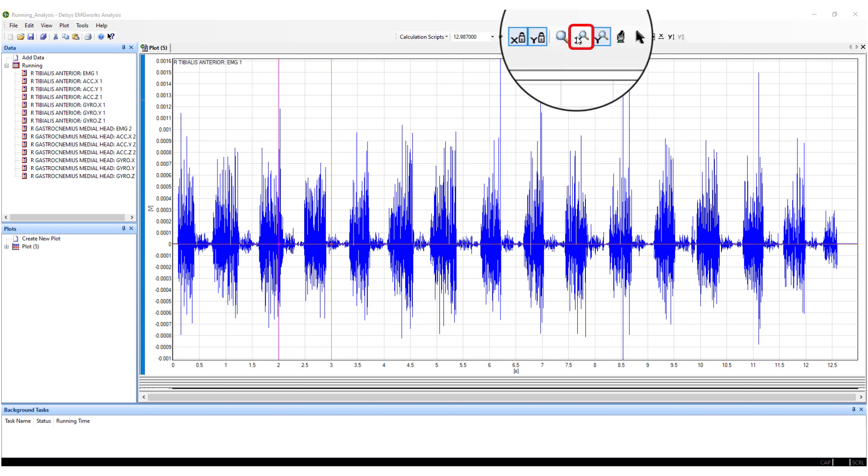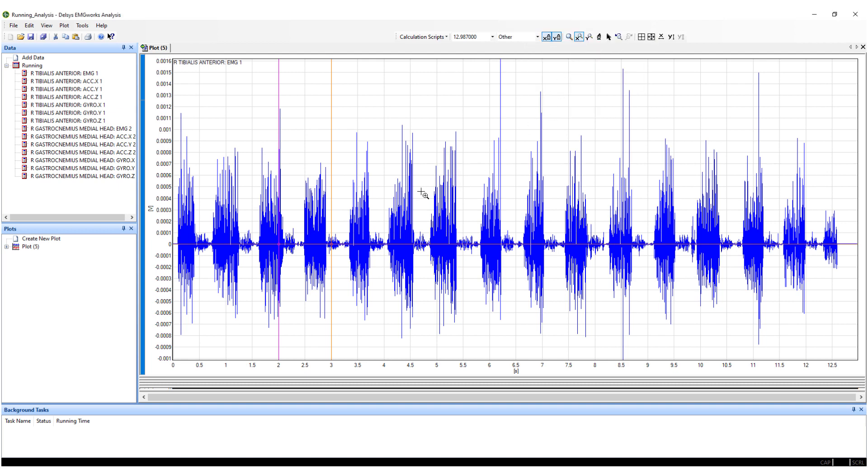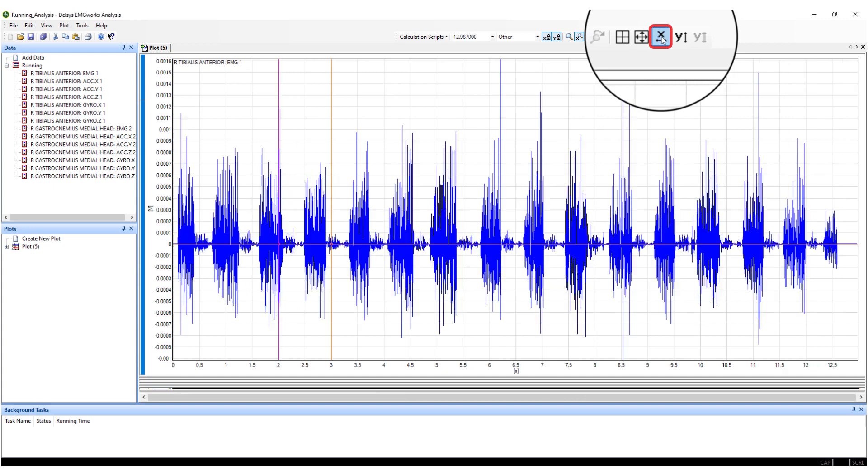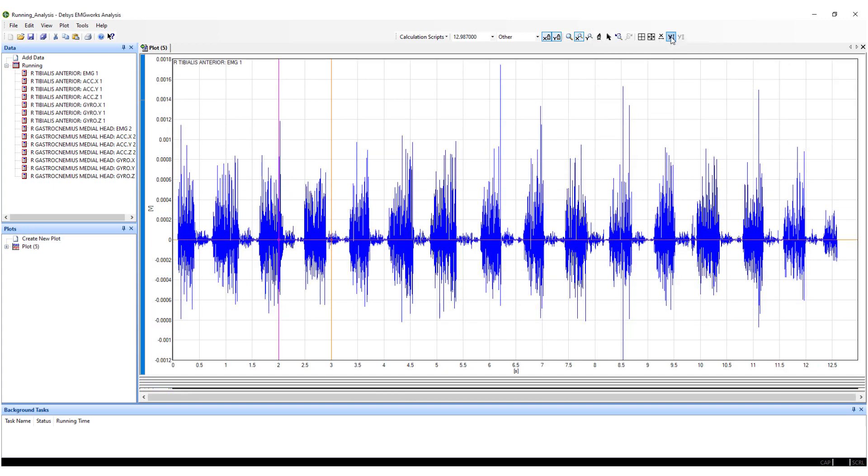Repeat the process by selecting the Zoom X icon to adjust the X-axis of the plotting window. To best fit all the data within the plotting window, use the Auto Scale function for both the X and Y-axis.